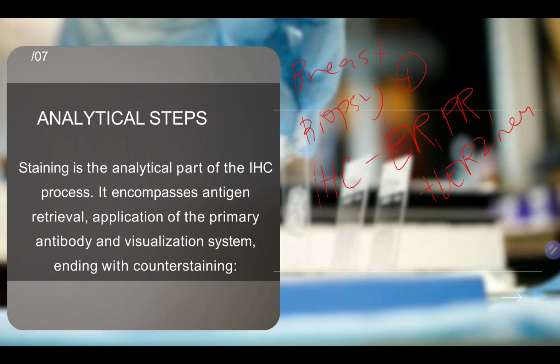So, sa analytical step po ng IHC is the actual staining po. The staining procedure for IHC is very long. That's why usually pag sa histopath po, 1 day po siya gina-perform. I mean, gina-dedicate po ang buong araw only for IHC lang. Kasi, yes, it's a very tedious task po. Sa part din natin na medtech, kasi medtech po nagpa-perform nito. So, staining is the analytical part of the IHC process. It encompasses antigen retrieval, application of the primary antibody, and visualization system, ending with counter staining.